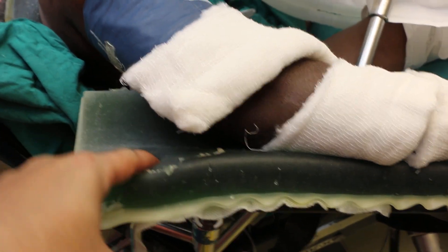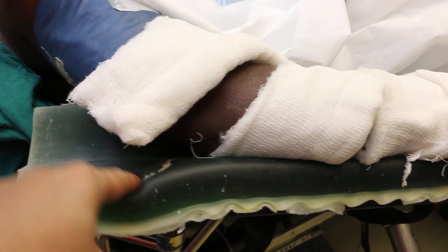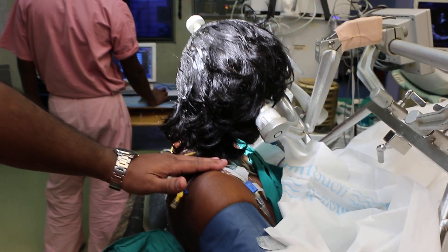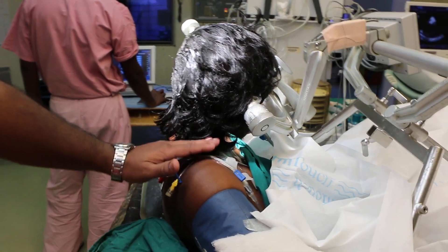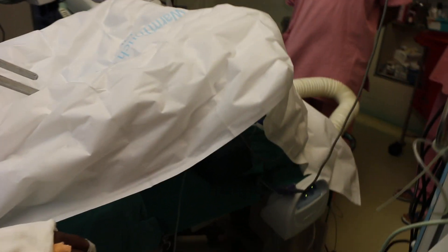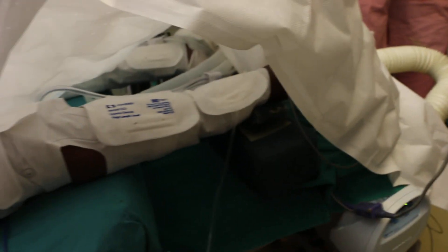The compression boots have been applied and the hands have been placed in a hand rest with a silicone gel so that the ulnar nerve is not compressed. There is no extension of the brachial plexus. Thermal blankets have been applied so that thermal loss does not occur.